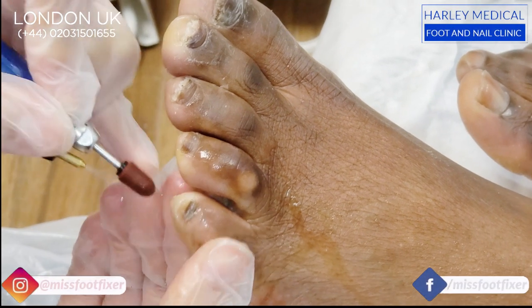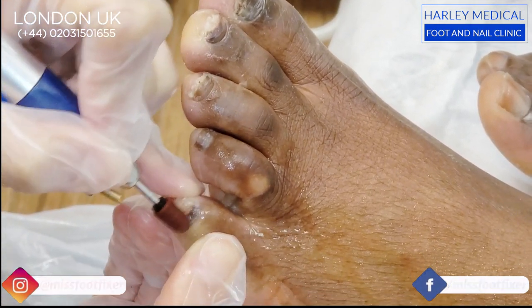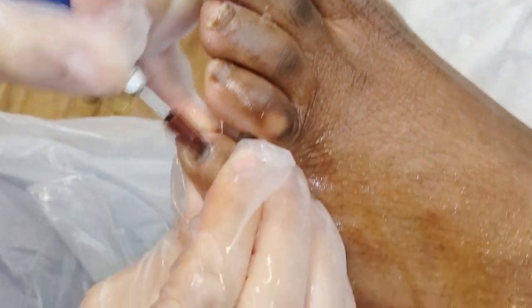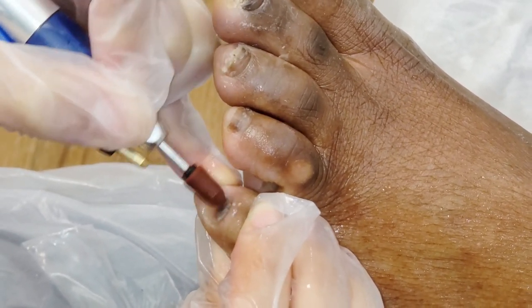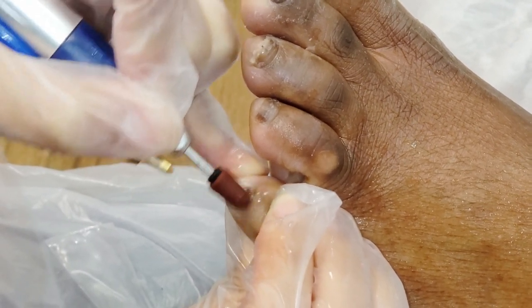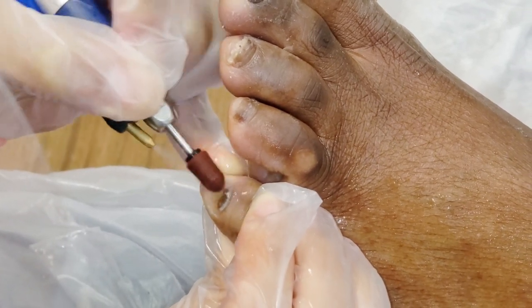We have some fungal nail infection and it causes a lot of pigmentation and thickening of the nails. As you can see, the nails are extremely thick. What we're going to do today is just file all this back and clean the nails up so that when we apply the therapy, it can penetrate a little bit more and there's less fungus to fight against, which is really important.